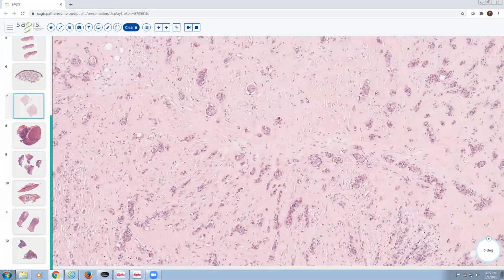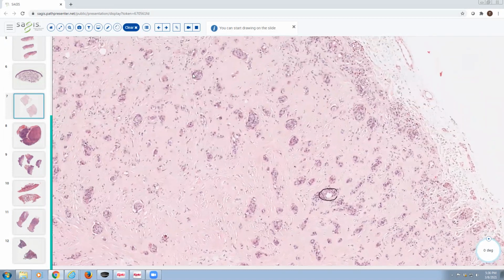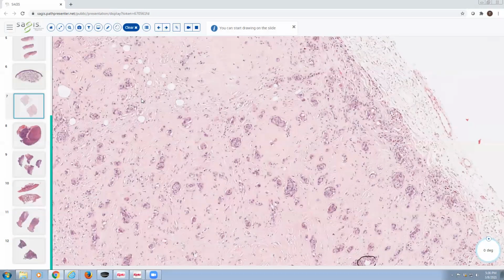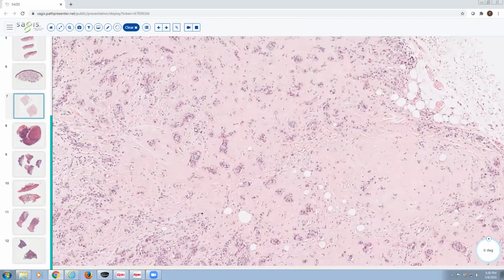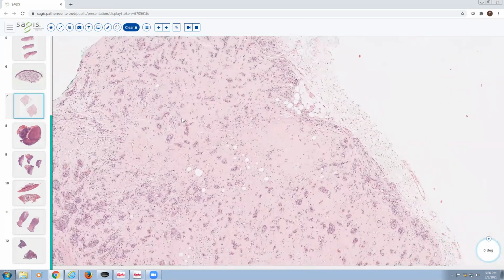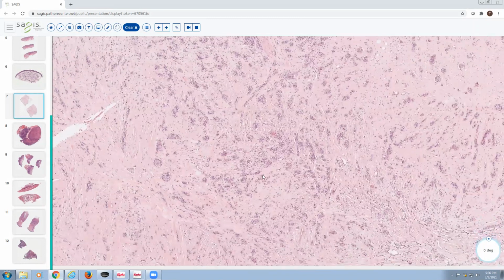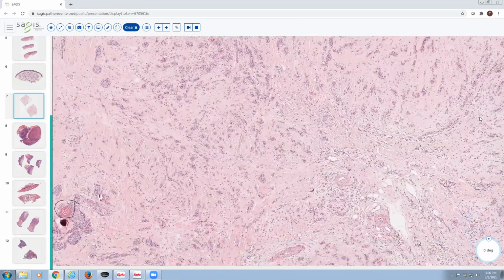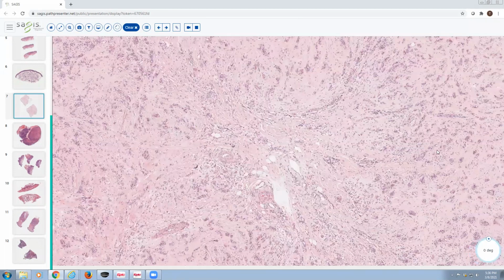So I start to see these small ducts that look more like eccrine differentiation. Sometimes you'll even see that spongy gray sweat material inside the lumen. So there's a kind of transition, superficially resembling follicular and then deeply resembling eccrine. Cords and strands of tumor cells situated in a sclerotic stroma.